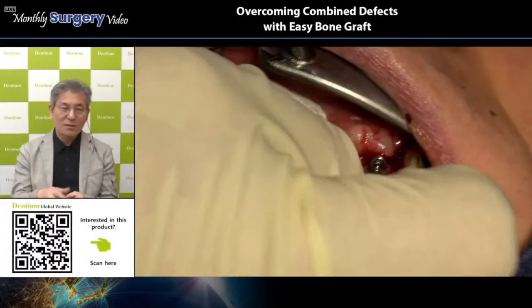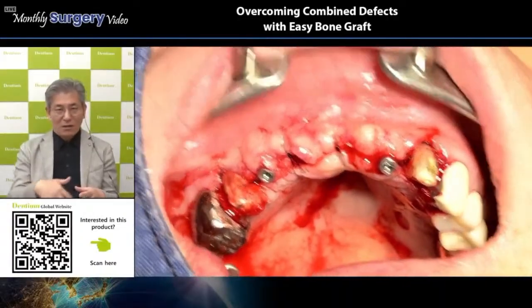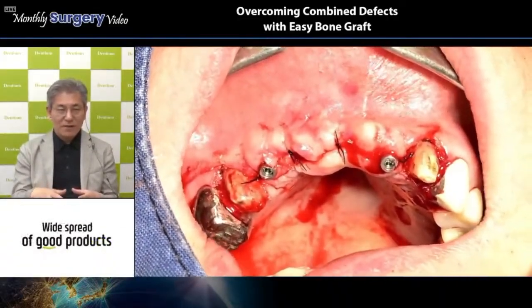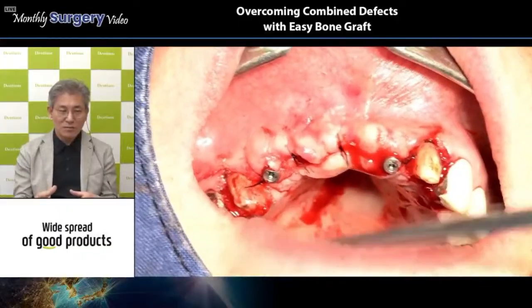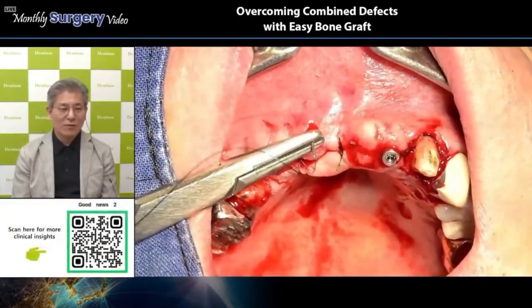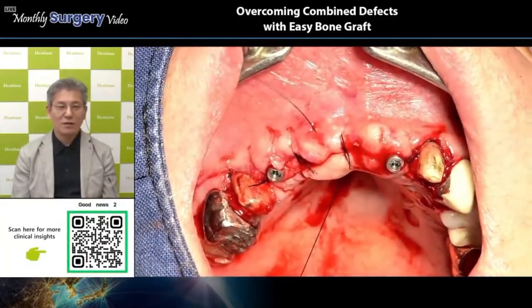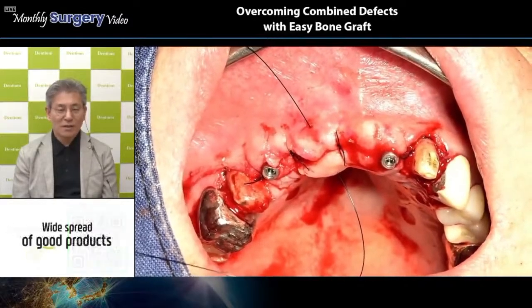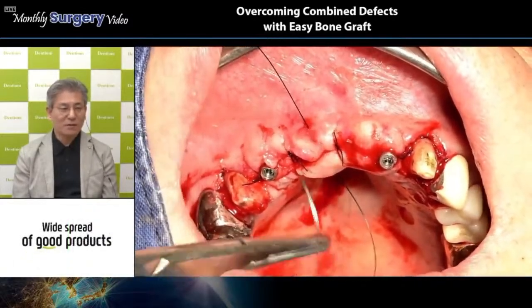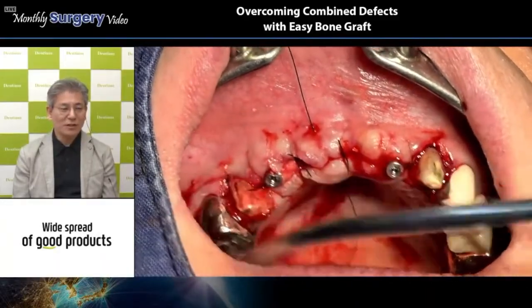So first, implant fixation, with almost all the surfaces of the implant fixtures surrounded by host bone, and then additional bone grafting with collagenated bone and the collagen graft to promote faster soft tissue healing.